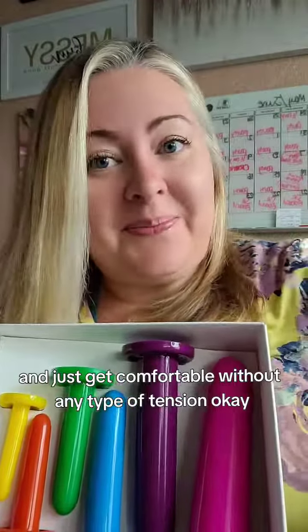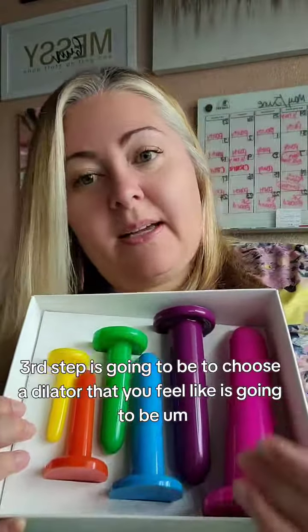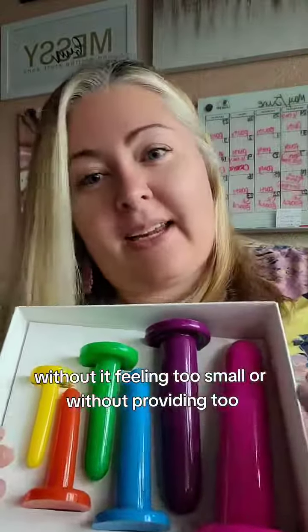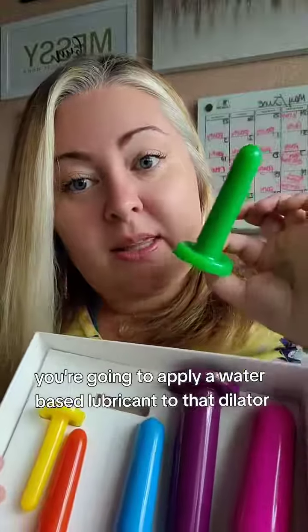Okay, the third step is going to be to choose a dilator that you feel like is going to be the most comfortable for you without it feeling too small or without providing too much tension. Okay, and once you choose that, you're going to apply a water-based lubricant to that dilator.